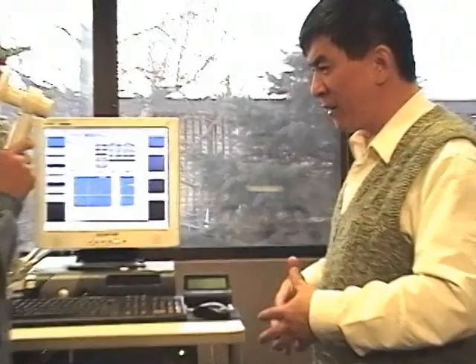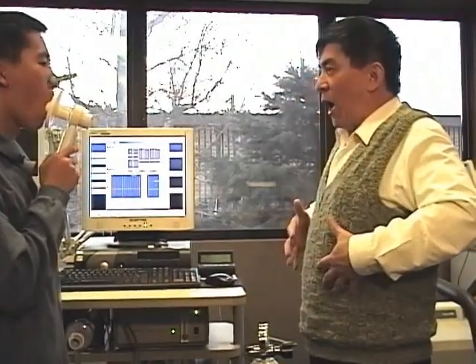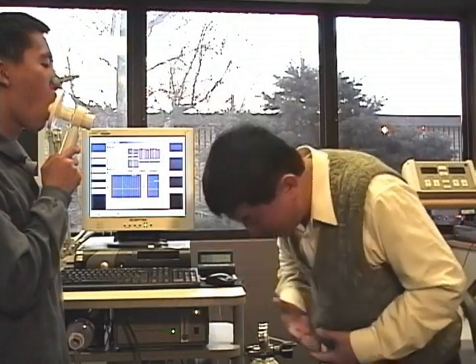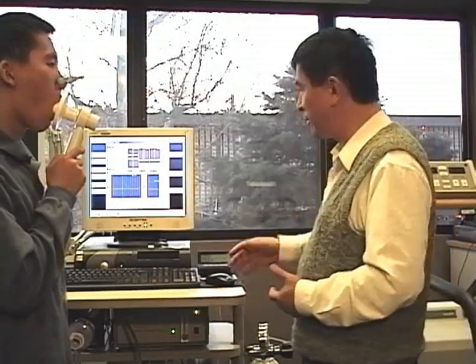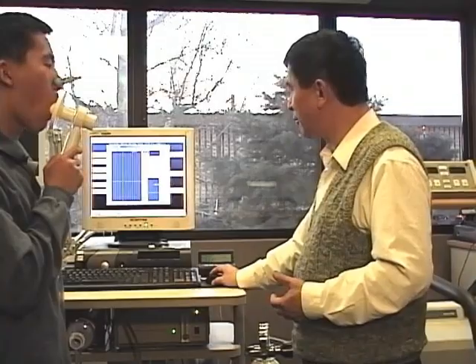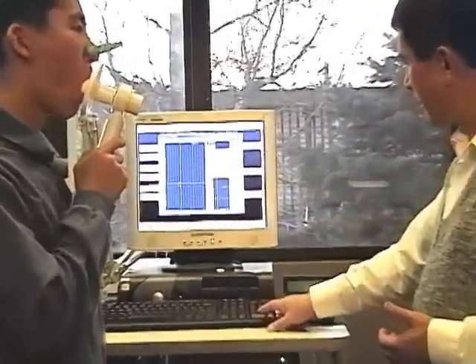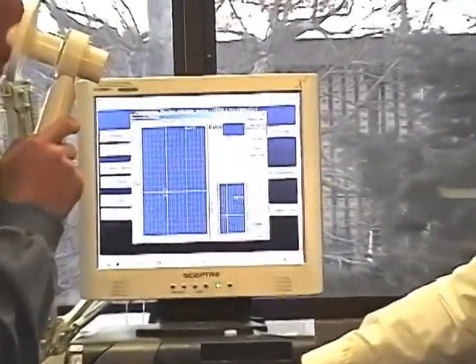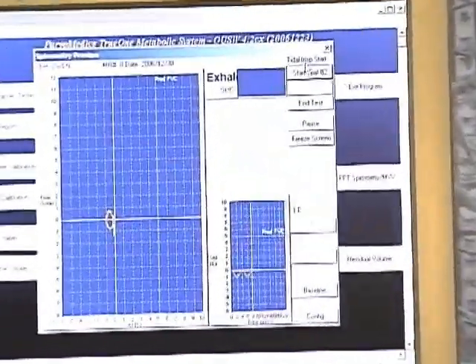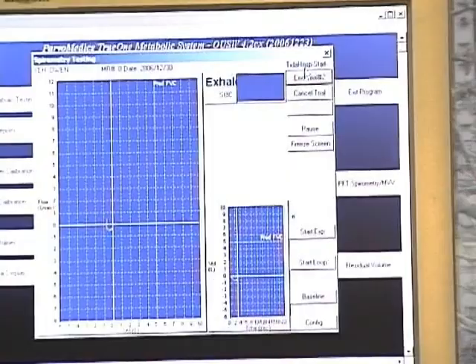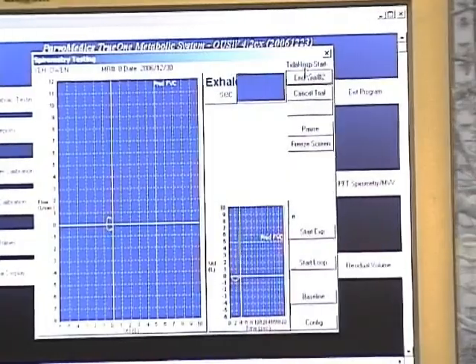After you inhale as big as you can and hold, then you exhale — you can even bend forward. We'll save this one. Now we are in tidal breathing again. A couple of tidal breaths, then we'll start the testing again — after one or two tidal breaths.